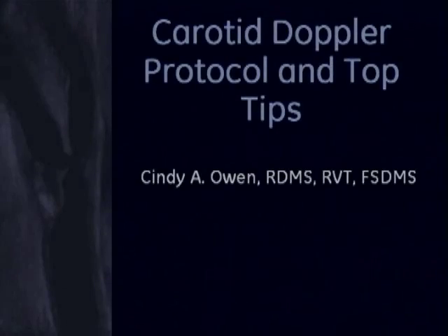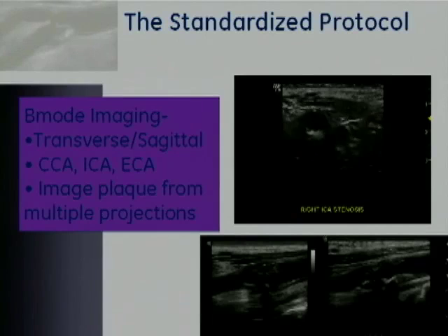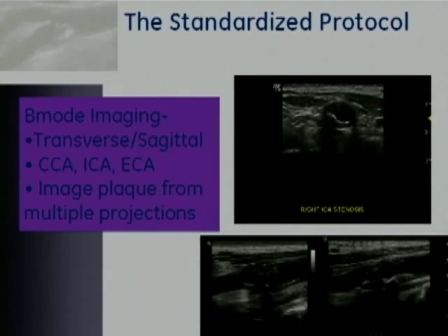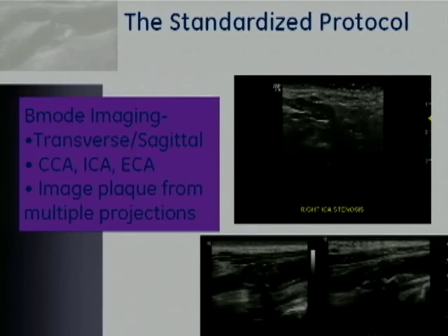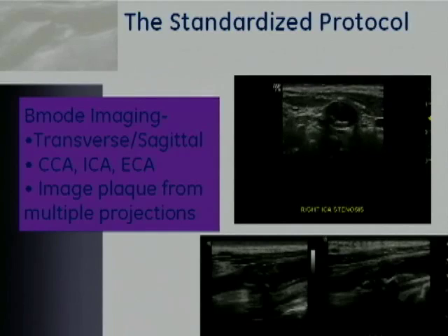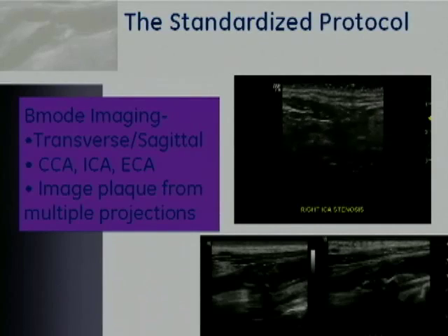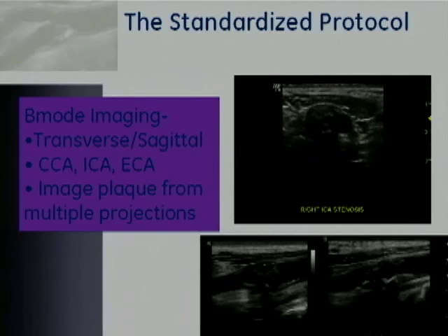I'm going to talk about carotid Doppler protocol and some tips for performing the exam. What I'm going to start with is the standardized protocol. It's very important that within each lab performing carotid Doppler, you have a protocol that is written down and can be followed by everyone in the laboratory. This will standardize the procedure and is very important for follow-up of patients.